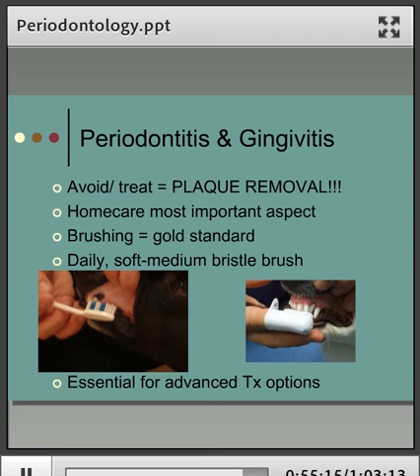And here you can see I'm doing a bit of a compare and contrast of a toothbrush with a finger brush, and hopefully this helps illustrate why a finger brush is not good enough. We need to clean below the gum line, and you can see that the bristles will get to the area, but there's no chance the little rubber tags on a finger brush will. Also, your finger's quite big and bulky, and the smaller the bristle head, the better, because it can get in and around all the nooks and crannies and clean more effectively. Also, you might get your finger bitten.